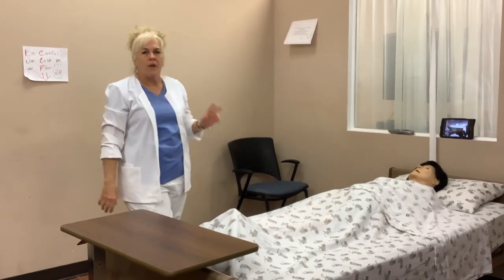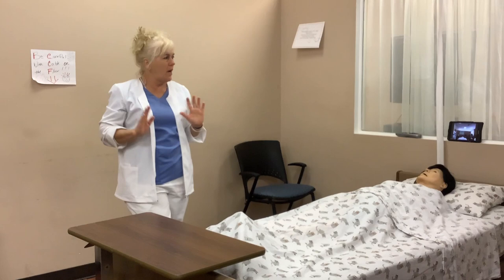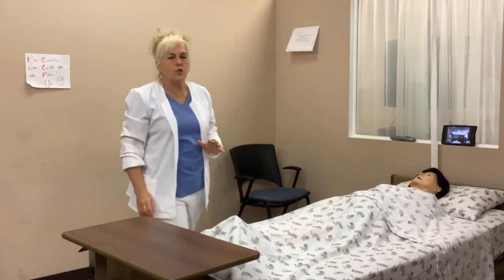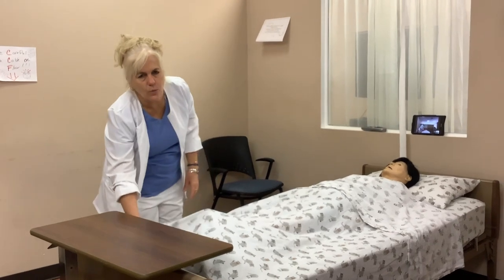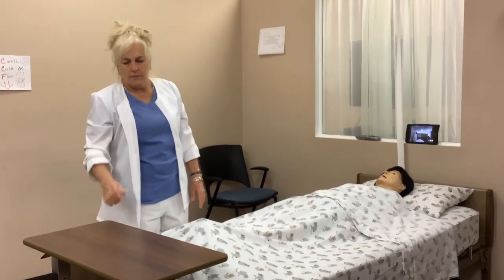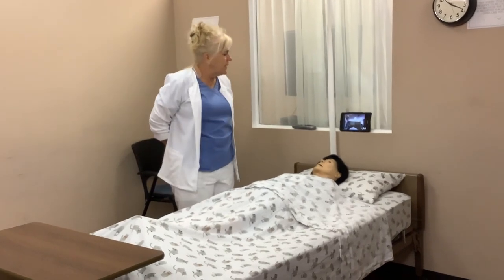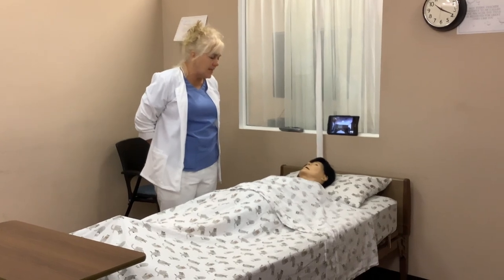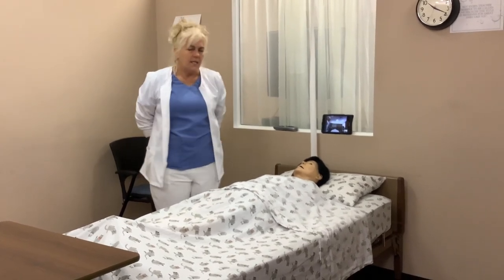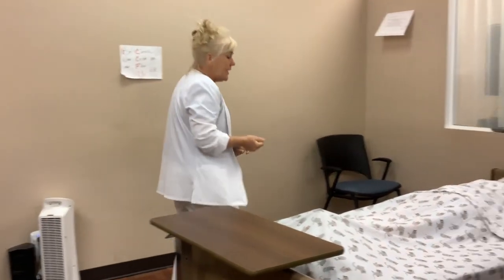Right now we're going to do the first skill today: catheter care. We're going to start with the beginning. Good morning, Mrs. Smith. My name is Nelia. I will be your CNA for today. I'm here because I'm going to do catheter care. Is that okay for you? Wash my hands. Check the name.